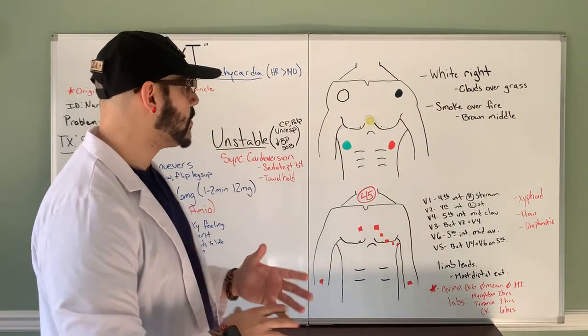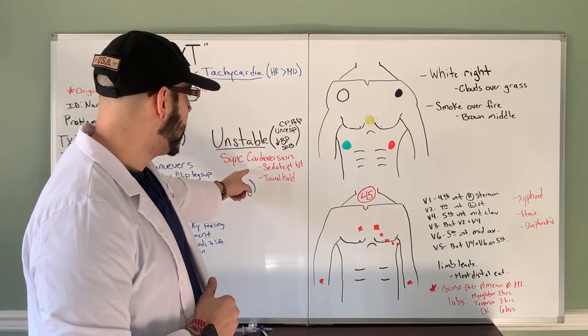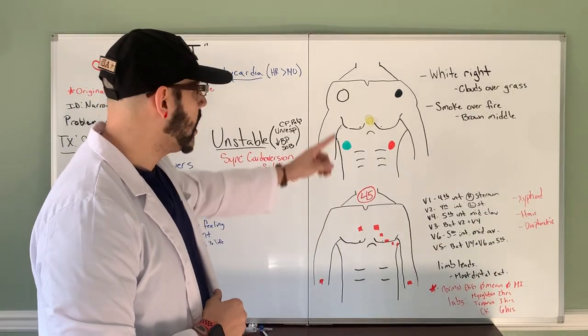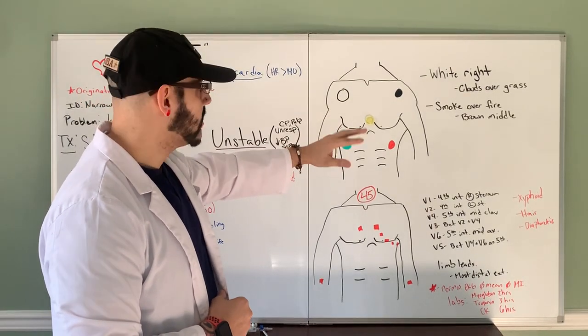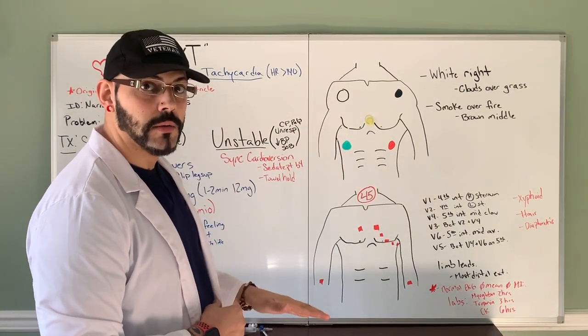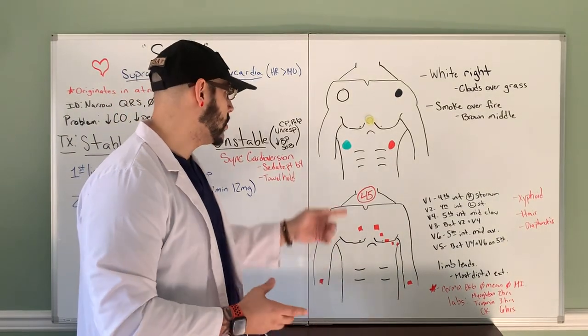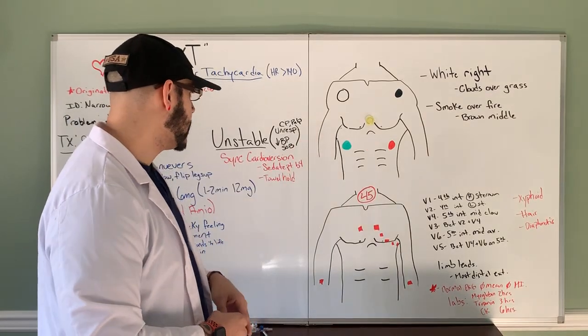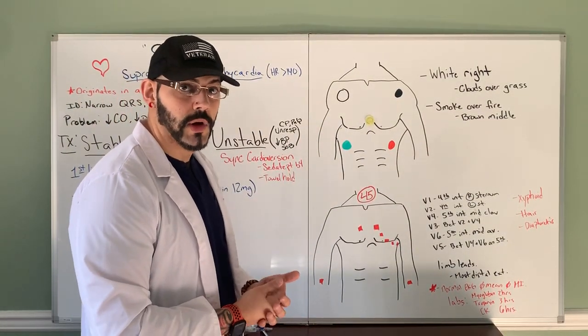So what you may see the provider do, I'm going to backtrack real quick. Make sure that this patient gets sedated, right? Because when you shock this patient, it's going to hurt. So make sure that this patient is getting some propofol, something to sedate them, so they don't feel this shocking as much as they would if they weren't sedated. So just ensure that the provider sedates them, okay? Sometimes providers forget things and you have to remind them, okay?